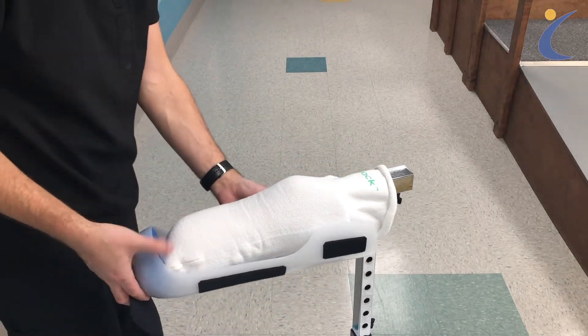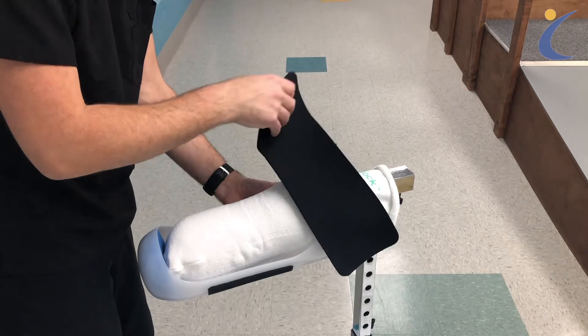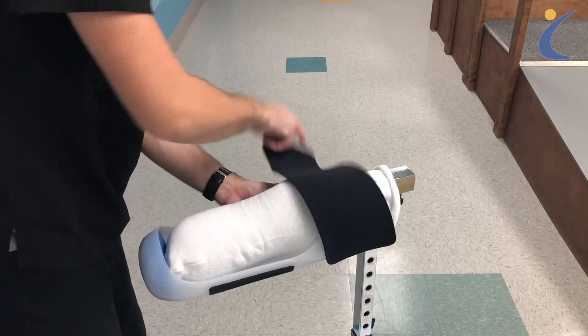Place your limb inside the device with gentle contact at the bottom of your leg. Tighten the top band first to better secure the device in place.